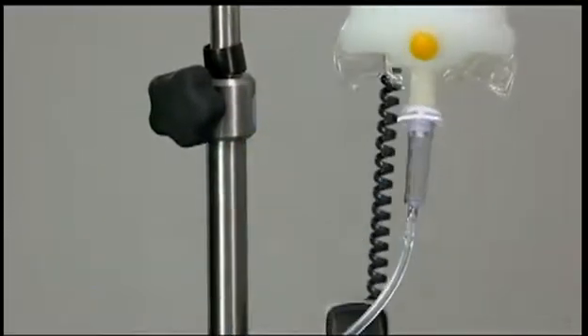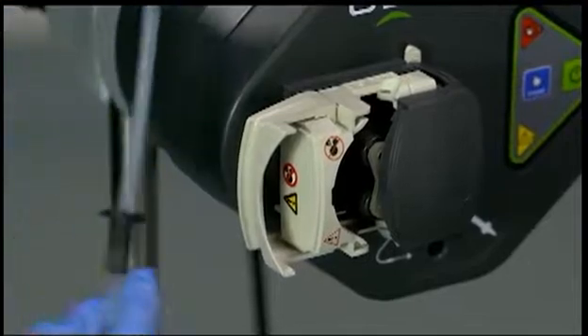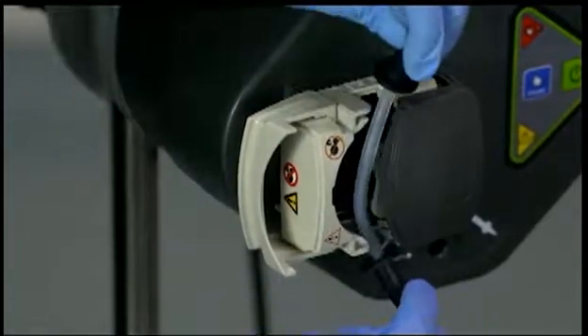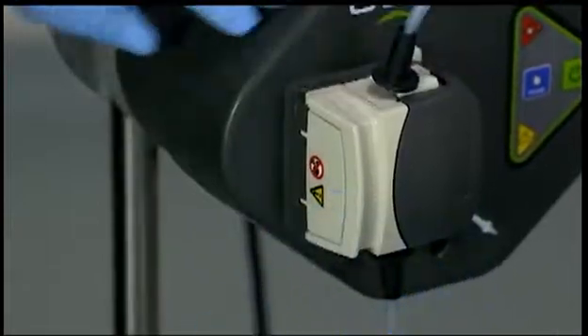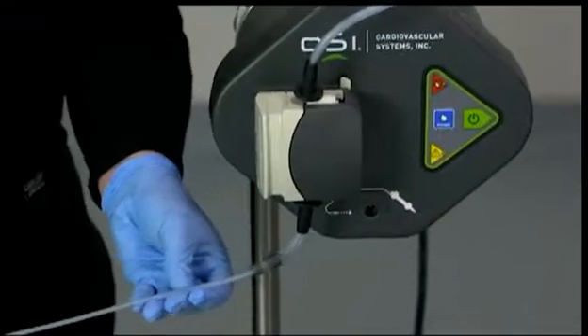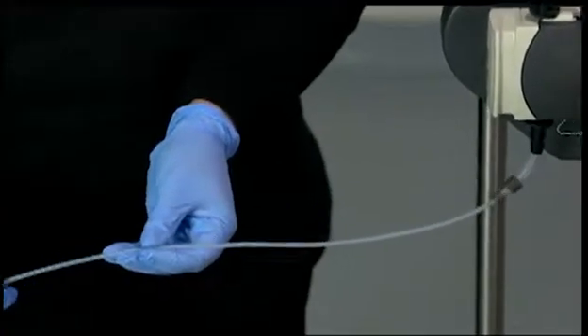Ensure that there is slack in the tubing between the pump and saline bag. Open the pump tubing door and place the saline tubing into the grooved guides of the roller pump. Close the roller pump door. Verify that the saline tubing is not kinked or damaged and that the tubing is properly inserted into the roller pump.